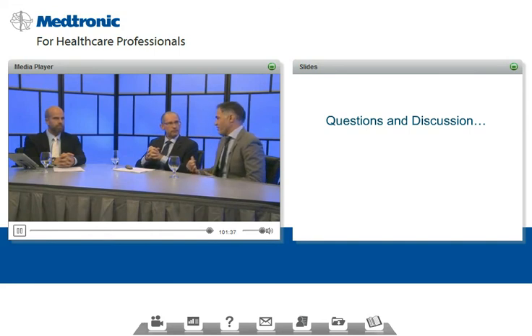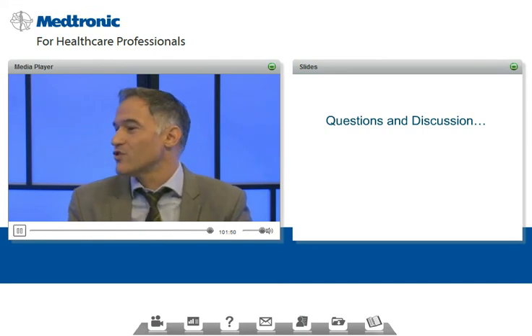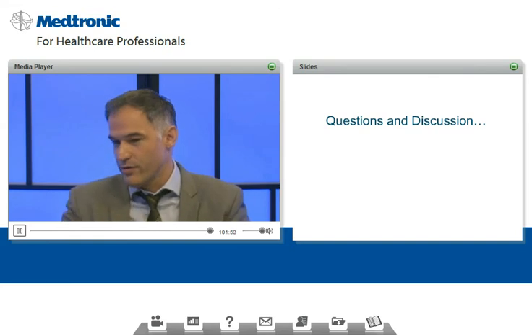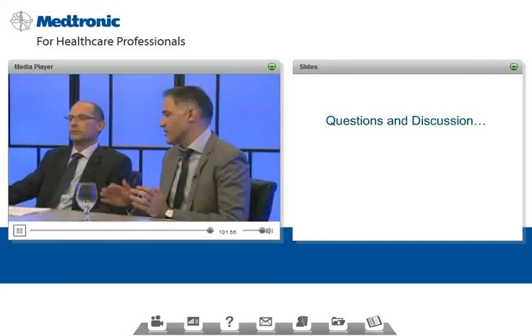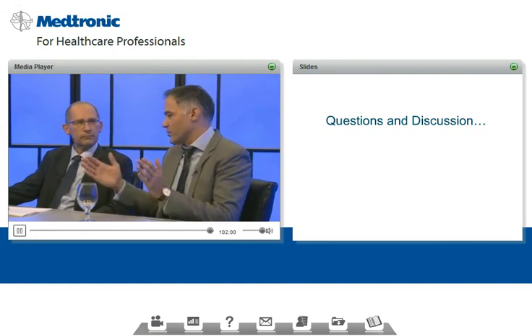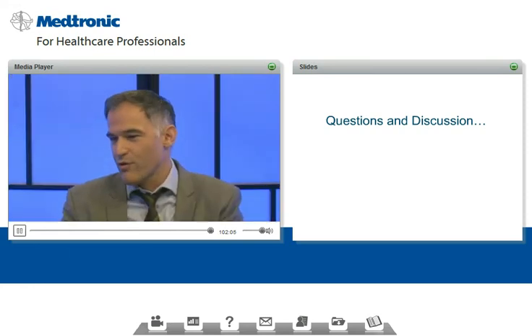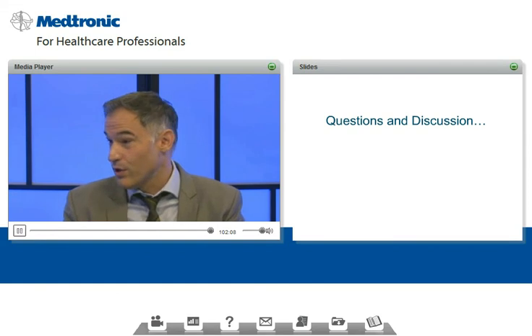Yeah, actually, I hadn't even thought about it in that way. That's really wise. To me, the concept of active insulin time is such a good concept to begin with. Whether it's 3 hours, 5 hours, or 4 hours is probably not going to contribute so much to the patient. But I agree with you that the size of the bolus will influence its duration. So for me, the concept is so good. If someone's struggling with lows when they have boluses close together, maybe it's because they've got a carb ratio that's too aggressive, or a correction ratio, or their target's set too low. There are so many things we could change, and the active insulin time is one of those things.